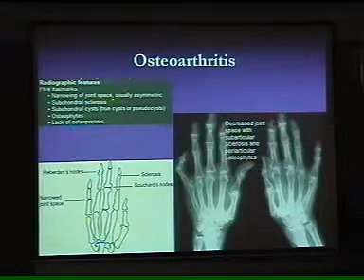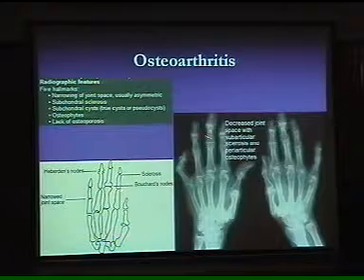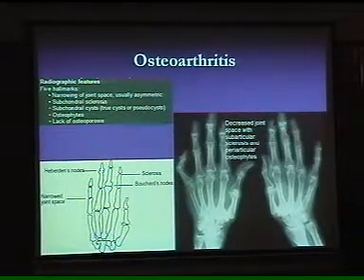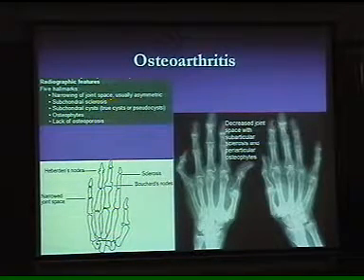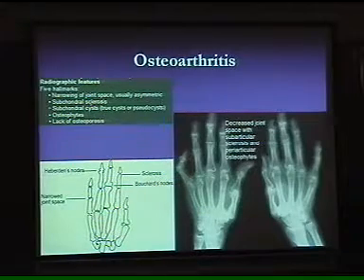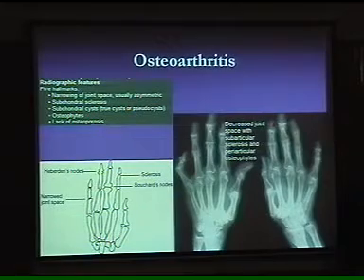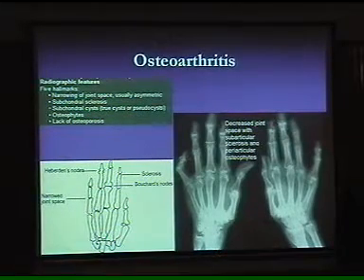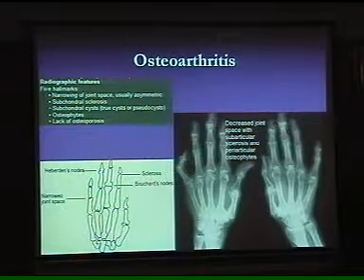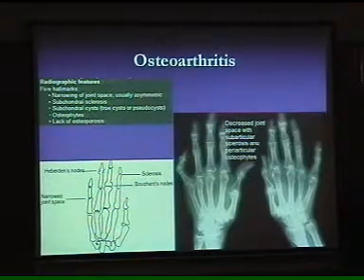Narrowing of the joint spaces, usually asymmetrical. That is very diagnostic, because when we discuss rheumatoid arthritis, it is symmetrical, as we saw in one of the early slides. Subchondral sclerosis is again a reparative response. The bone matrix is decreasing, but because of the response of the bone, there is a sclerotic element going on there. Subchondral cyst, true cyst or pseudocyst: these cysts are basically because of a break in the articular surface. As a result, synovial fluid oozes into the areas, and that leads to the formation of the cysts.